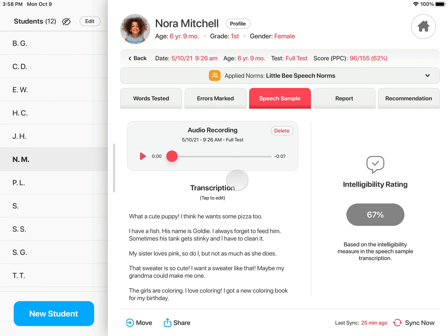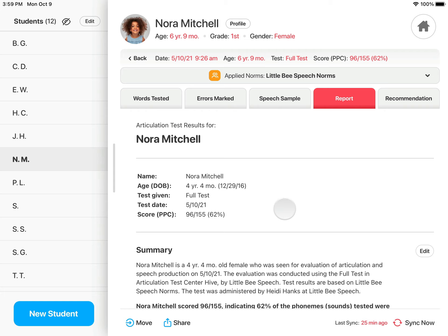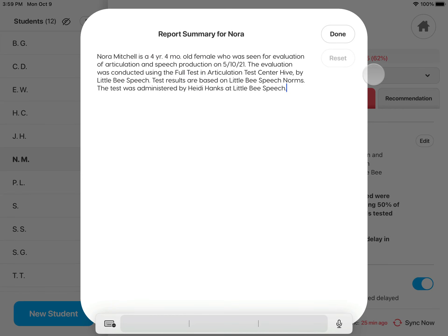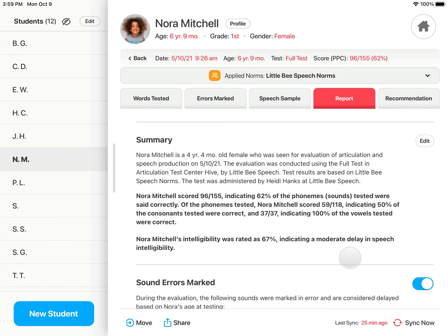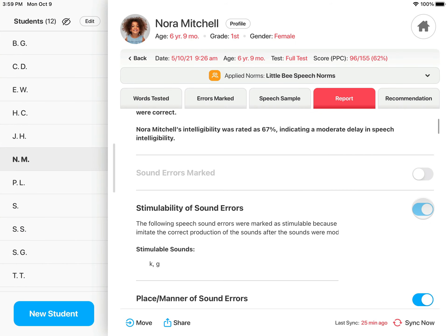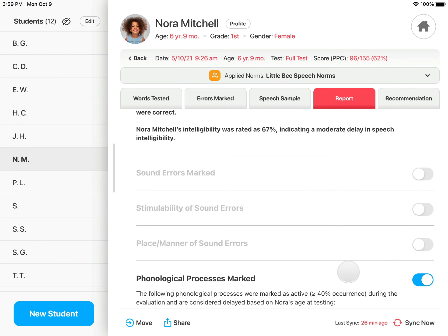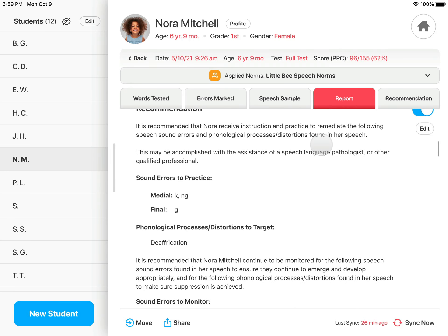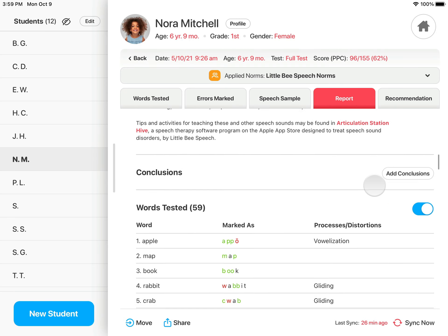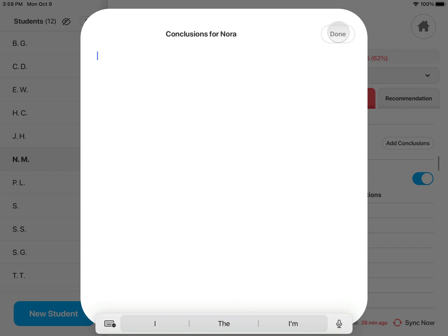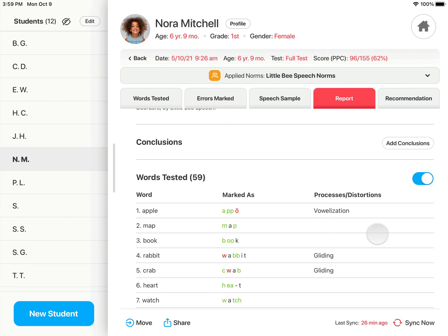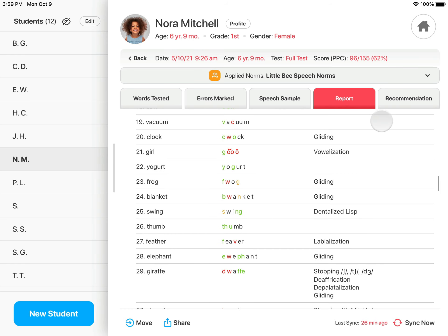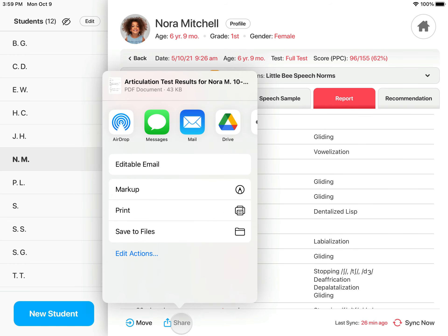The Report tab provides a written summary of all the test results. You can edit portions of the report by tapping Edit, or you can show or hide portions of the report. You can also add your own conclusions. The Share button provides several ways to share the report.